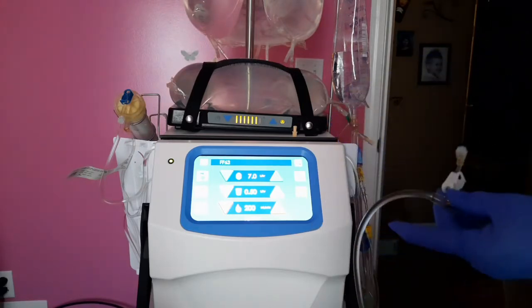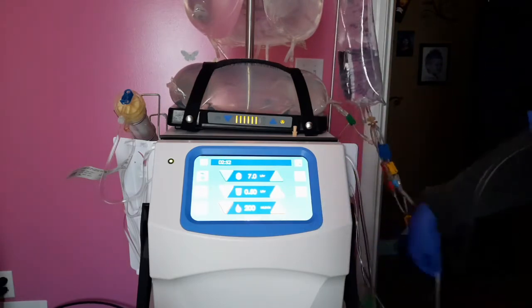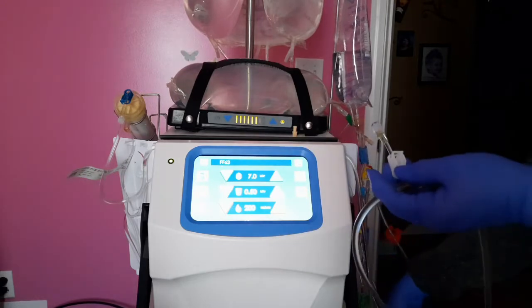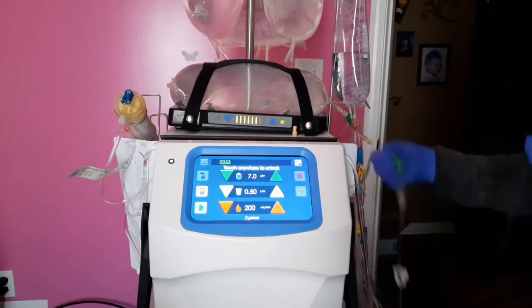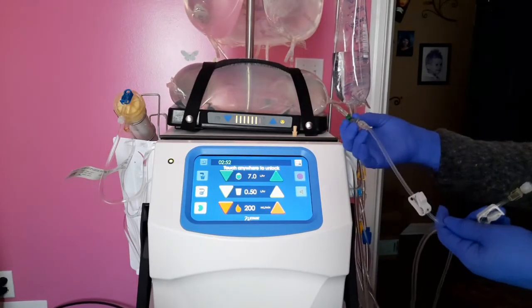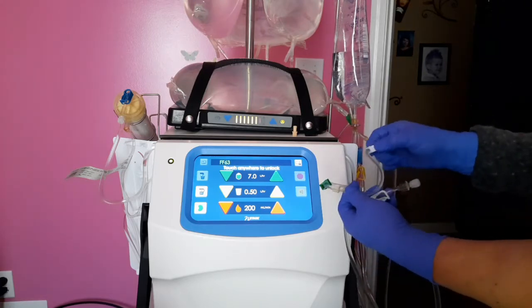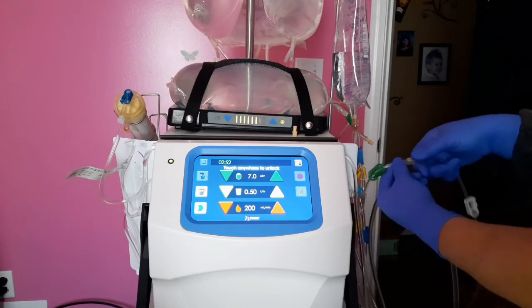All right. So, we're holding on to this. We're going to find our dialysate line, which also has attached to it the partner to this one, the other white line. So, the dialysate line is green. So, here's the green, and here's the white. So, we got to separate these two. We got to connect white to white. So, first thing we do is we clamp the green, clamp the white, so that we can open it without fluid and air going all over the place.